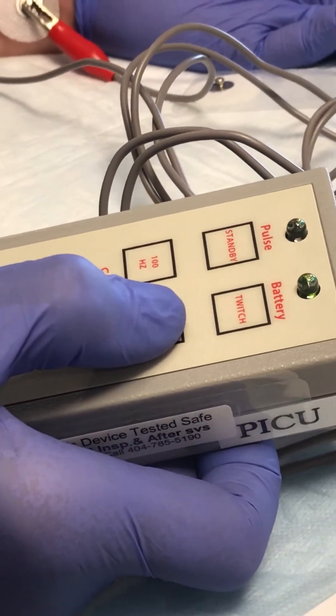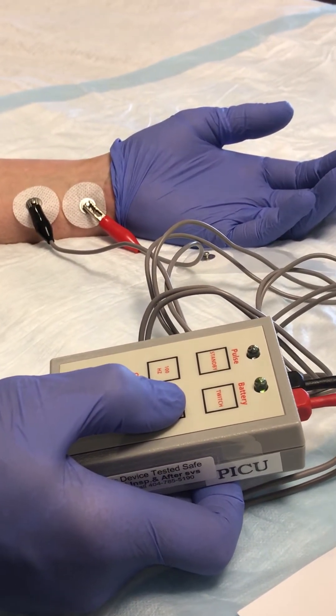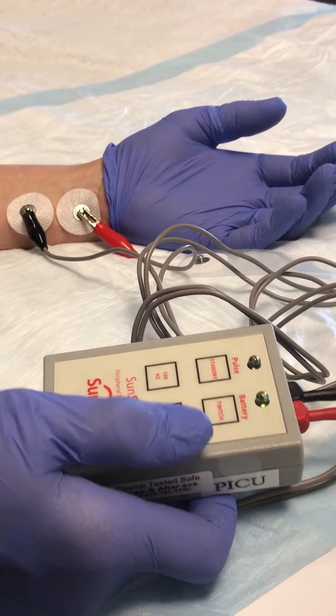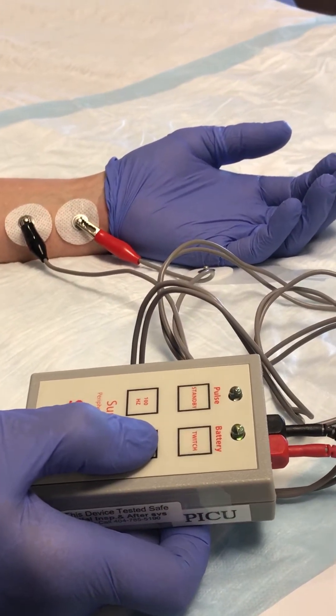Push and what you're expecting to see is thumb twitches. You achieve the train of four when you have four complete thumb twitches. That was not four complete, so turn it up by one and keep turning it up until four is achieved.